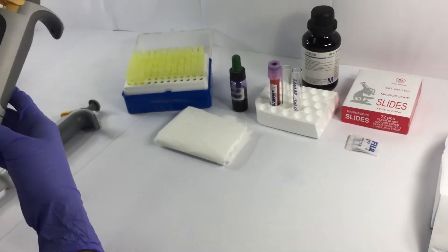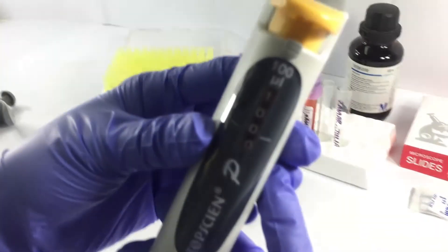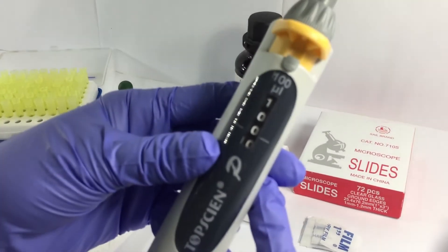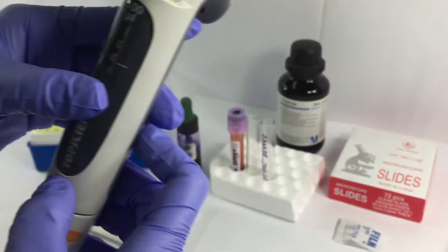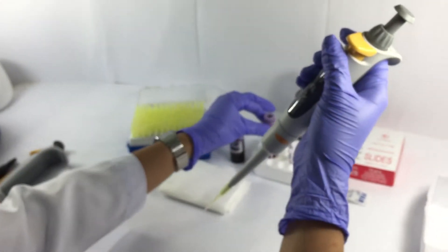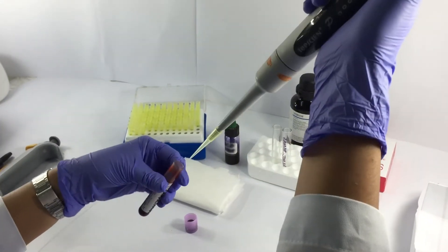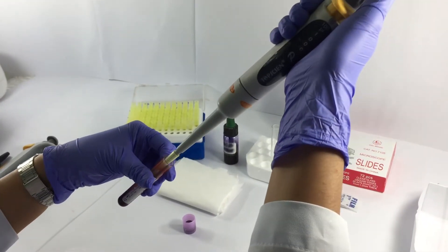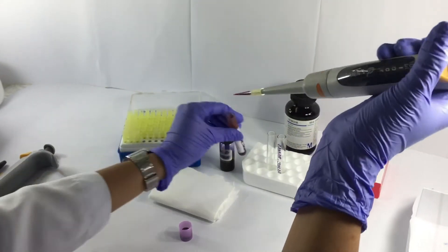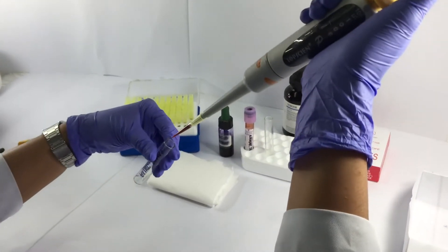Next, get your micropipet and calibrate or set the calibration to 100 microliters. Attach the pipet tip into the micropipet and aspirate 100 microliters of the patient's blood sample. The aspirated blood sample must then be transferred to the tube that was labeled earlier.